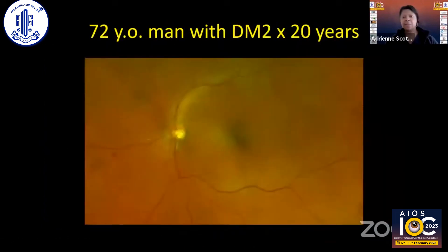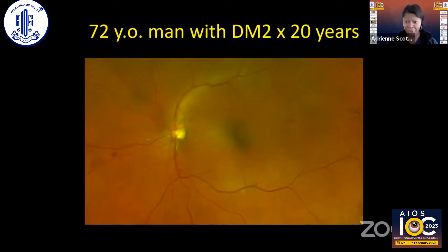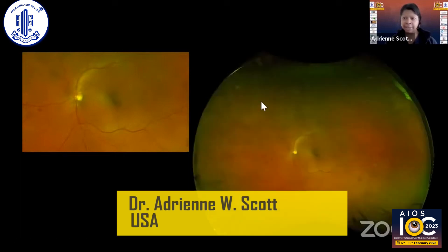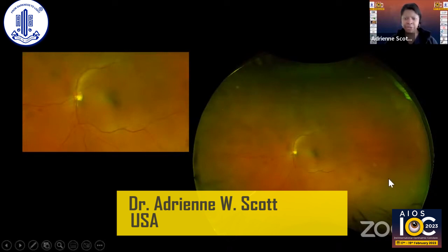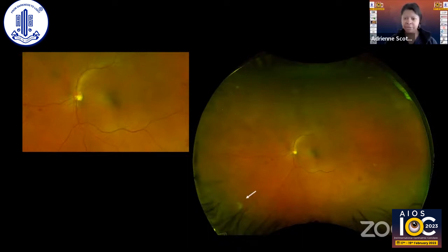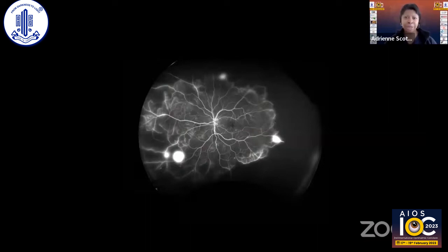I'll show an example of a case where ultra-wide field imaging helped me in a 72-year-old man with a 20-year history of insulin-dependent diabetes. From the fundus you can see some blot hemorrhages and the perfusion looks fairly reasonable from this view. But comparing the posterior pole view to the wide field imaging, we get much more information — peripheral possible neovascularization, significant areas of capillary non-perfusion out to the periphery. The ultra-wide field fluorescein angiogram was quite impressive compared to what I saw on fundus exam with indirect ophthalmoscopy. There is extensive non-perfusion and neovascularization, while the posterior pole is relatively well perfused.